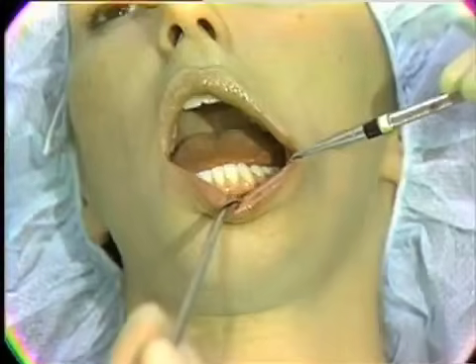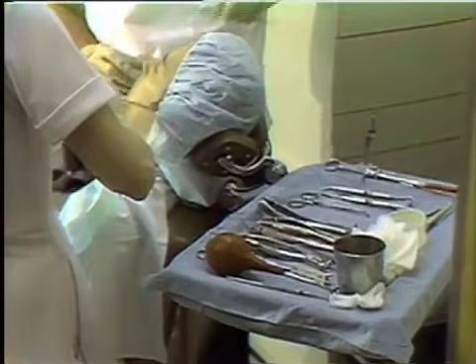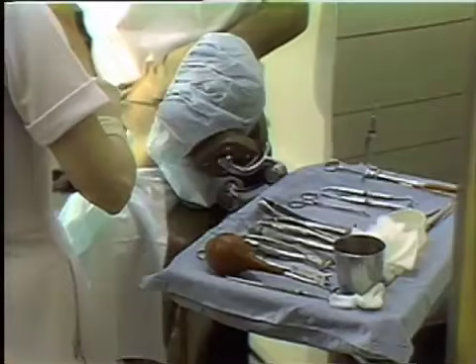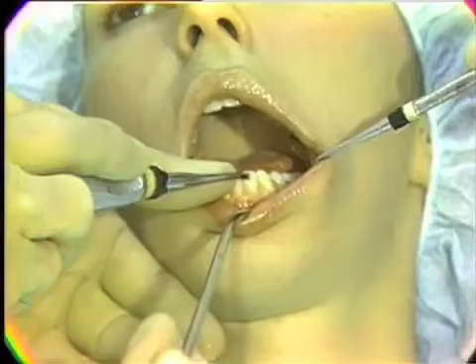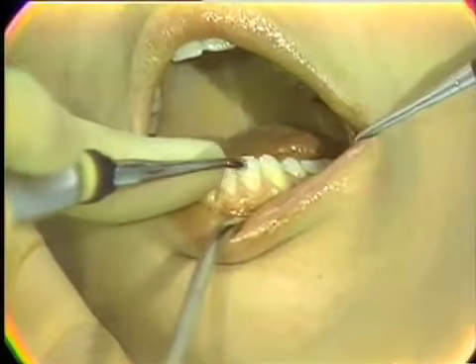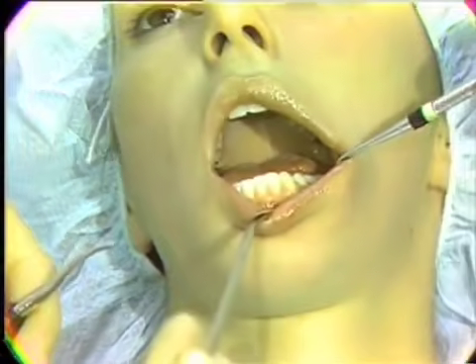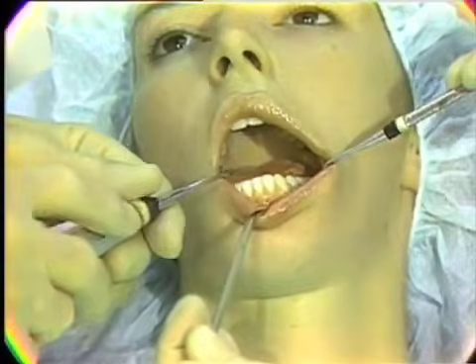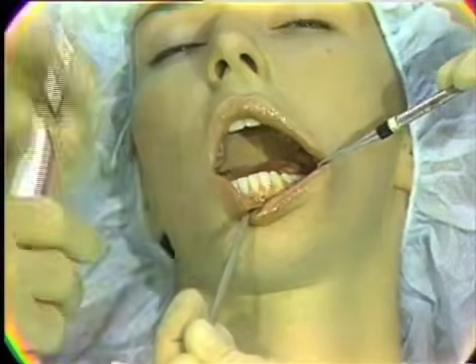If we then wish to mobilize teeth, we would use a dental elevator, and this 77R elevator is an appropriate one that then would go into the area of access from which the flap had been reflected so that we would not bruise any of the tissues. We never use this instrument unless the free gingival margin flap is retracted away, because the bone must be used as the fulcrum and not the gingival tissue.